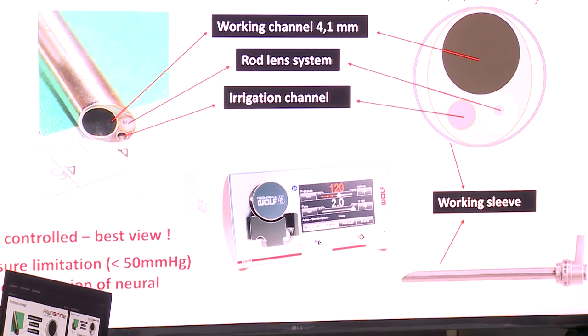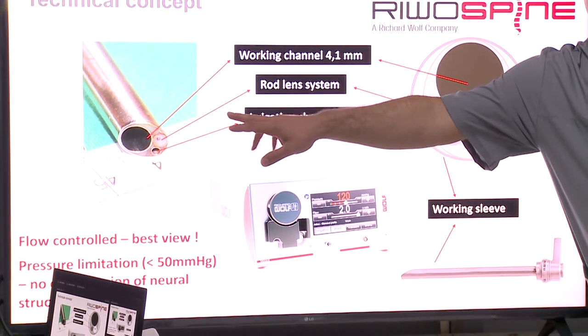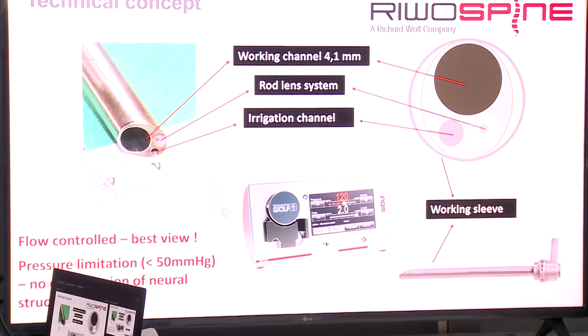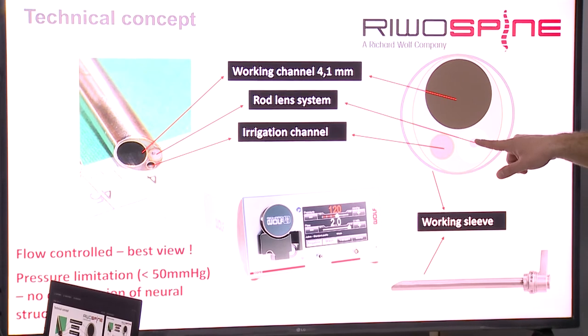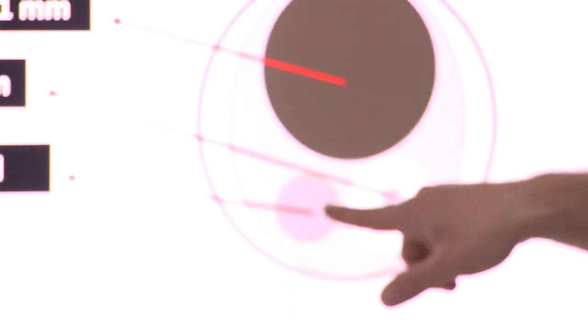Okay, let's look at this slide first. It's a 25 degree optic we use. And this is the working channel, 4.1. Camera, light source, and irrigation channel.